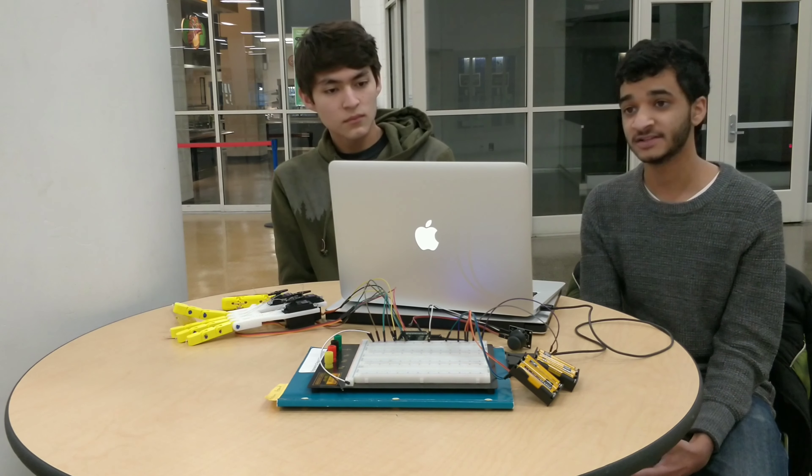This is the design we came up with. It uses commercially available servos to actuate fully 3D printed fingers with a fishing line. The project is controlled through an Arduino microcontroller and can be powered through a portable battery. You can control the movements with a joystick, and the hand can perform multiple gestures as well as grip objects.